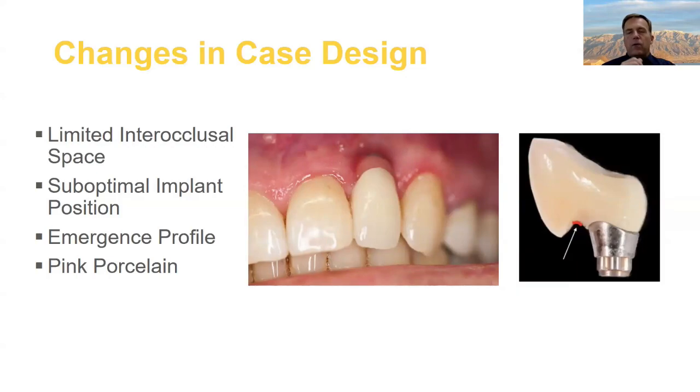A lot of the screw retained crowns that we do as zirconia have a cemented interface that we cement in the lab, but nonetheless, they're 2 pieces and that can come loose from time to time, but those can't. So if you have really, really limited vertical space, that could be a good option.